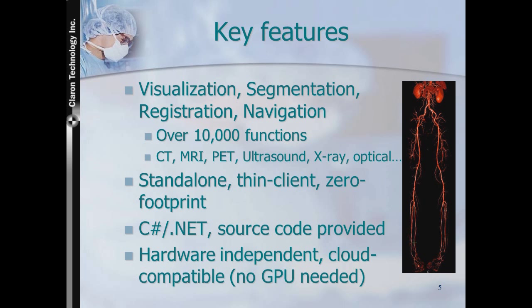Other than the classic standalone desktop application, WIF supports configurations where all the memory and compute-intensive operations are done on a centralized powerful server, while the users interact with the data remotely using lightweight or web browser-based clients. WIF was designed from the outset to take advantage of the best features of .NET. We provide the source code to WIF, and our customers not only step through WIF code, but also modify or extend it. The modified code is merged into subsequent releases.